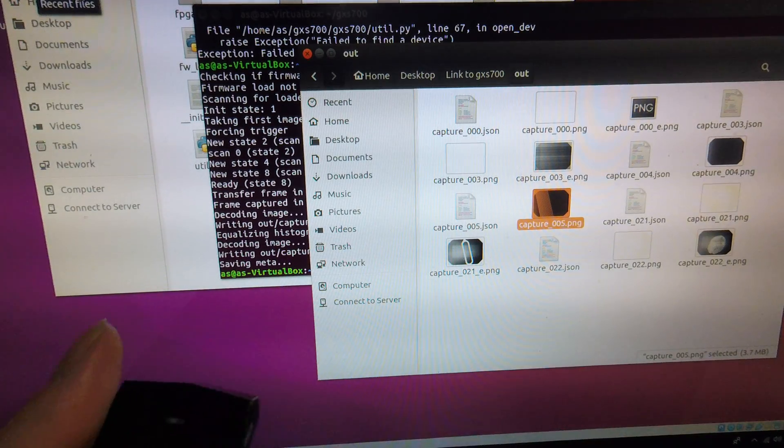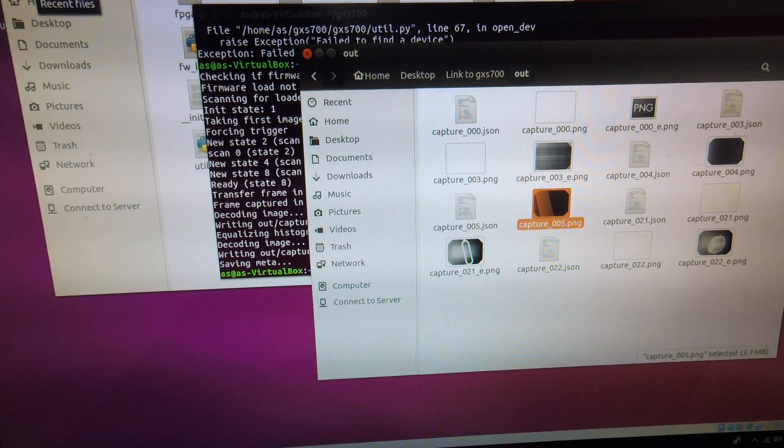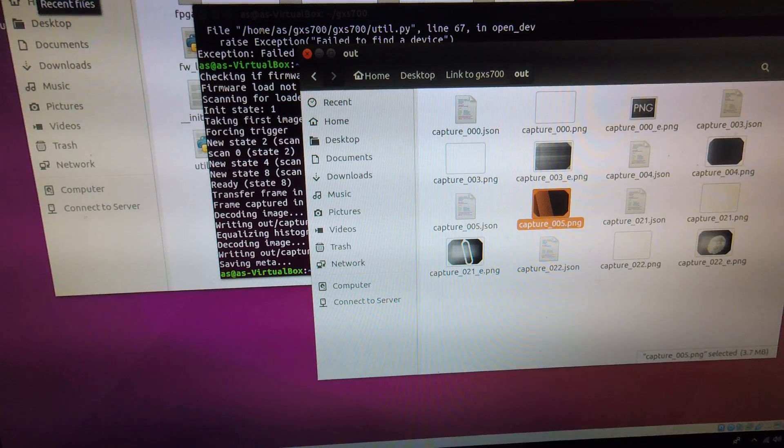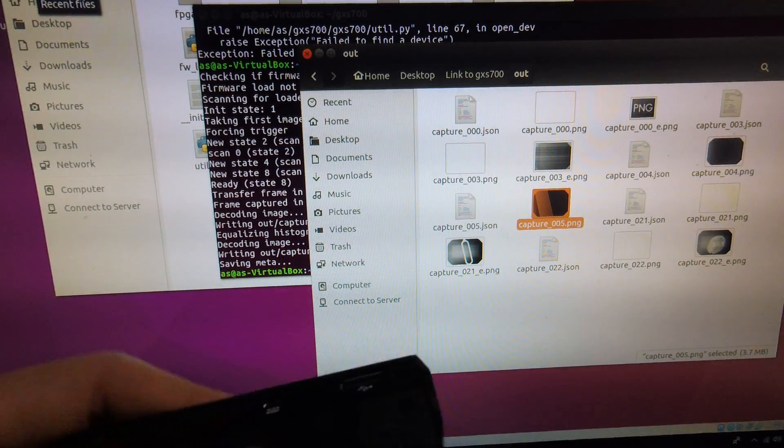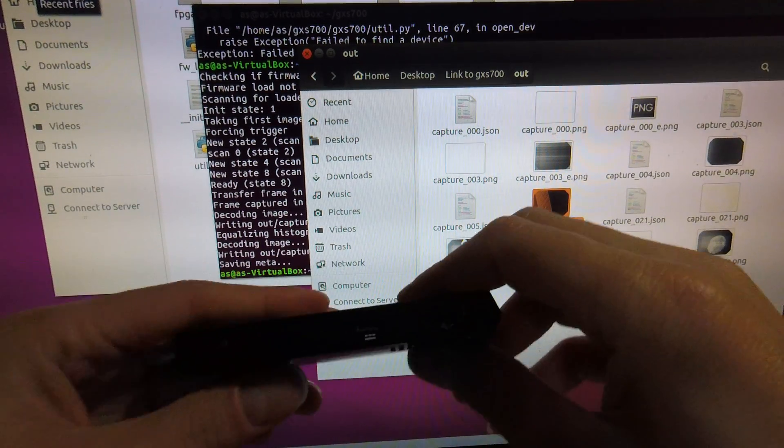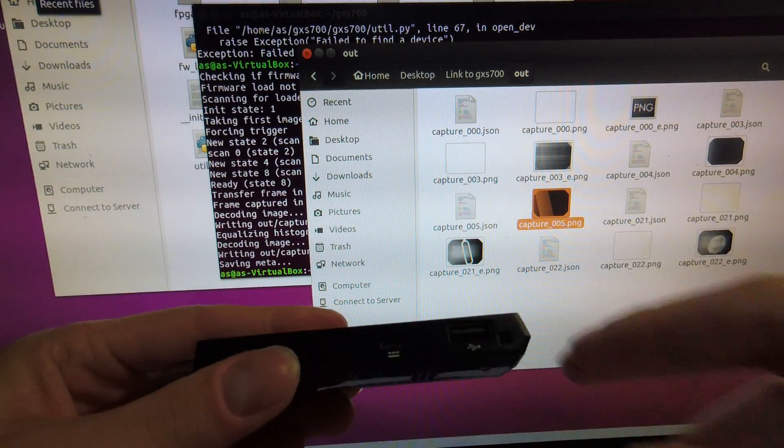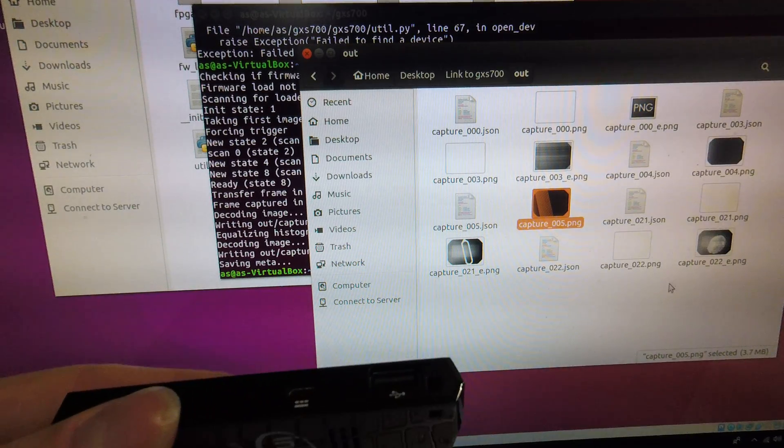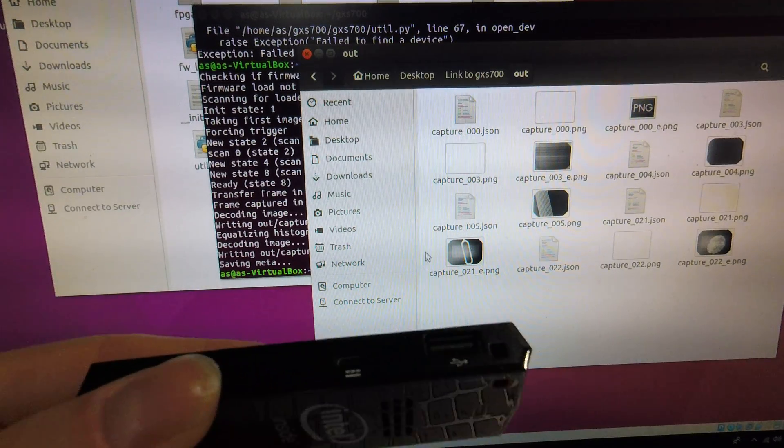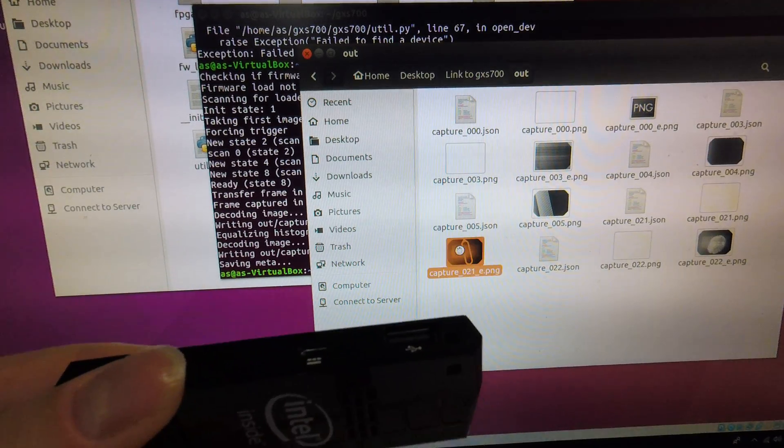This will not automatically trigger the sensor so you'll have to force exposure but it will register detection on the sensor.